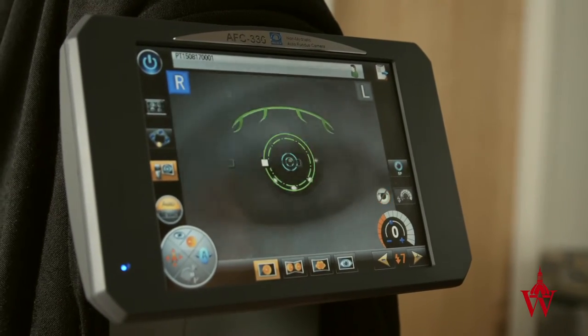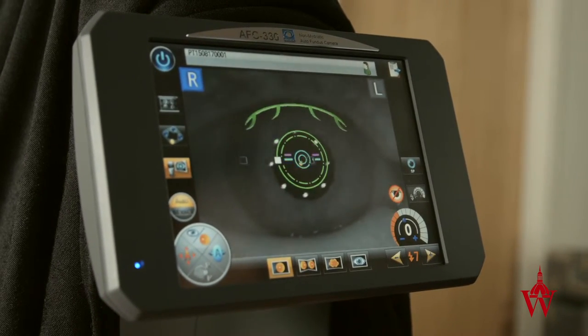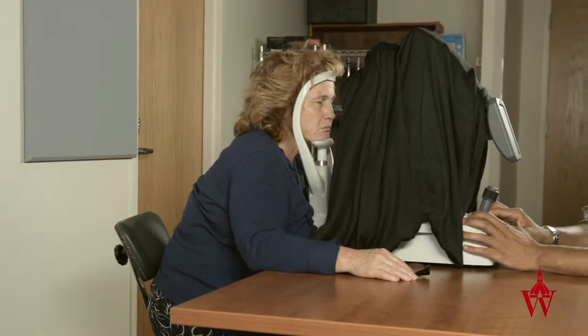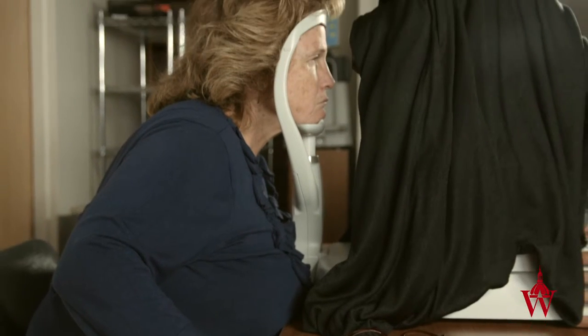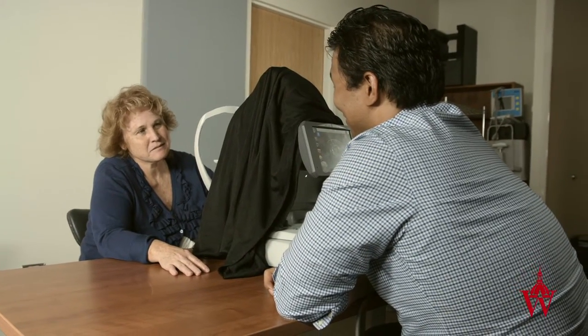If the patient has difficulty focusing, instruct them to look directly at the green light with both eyes. If the camera still will not take the picture, ask for help. If the patient cannot sit still, instruct them to steady themselves on the table and press their head firmly against the head rest, and explain that if they are moving the camera cannot focus and get a good picture. If the patient gets irritated with multiple attempts, apologize for the delay, explain the issue, and ask if they want to take a break before trying again.